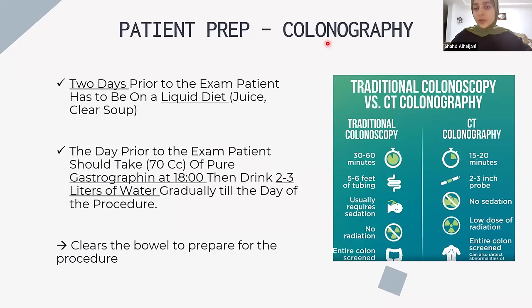Now, for colonography, we're done with CT. Now, for colonography, this is just a diagram to show you the difference between colonoscopy and colonography. So colonography will take less time, and it's a small probe that's inserted into the patient compared to colonoscopy, where you have the whole scope, so you have whole tubing inserted in the patient, and this requires sedation, while colonography does not require it. There is low radiation, and you can screen the entire colon.